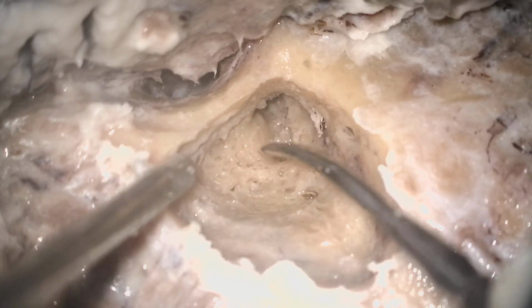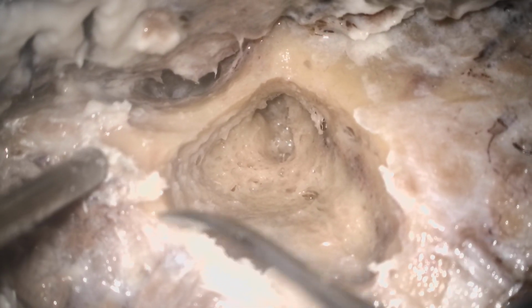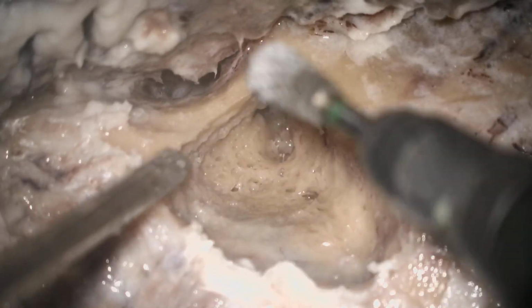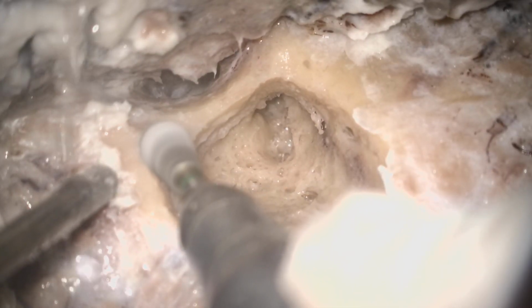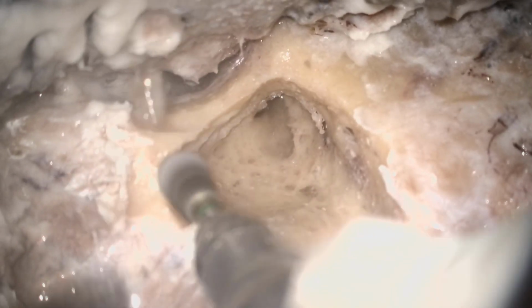Now we will go inferior to dissect all that area of the tip cells. There will be two groups of tip cells, the lateral tip cells and the medial tip cells. When you drill the tip cells, you will identify another important landmark, that is called the digastric ridge.